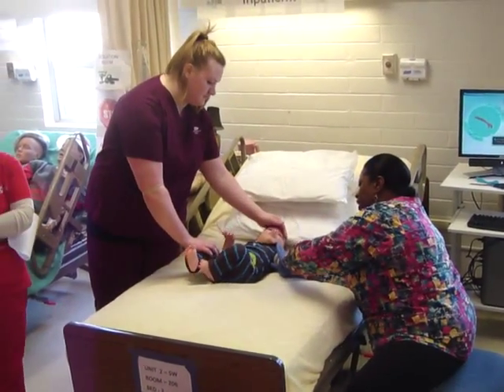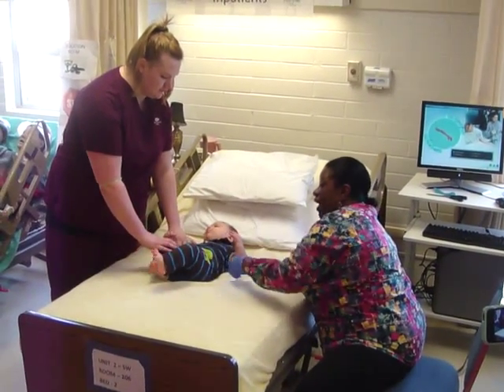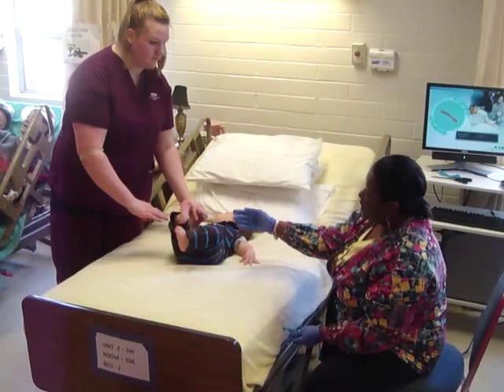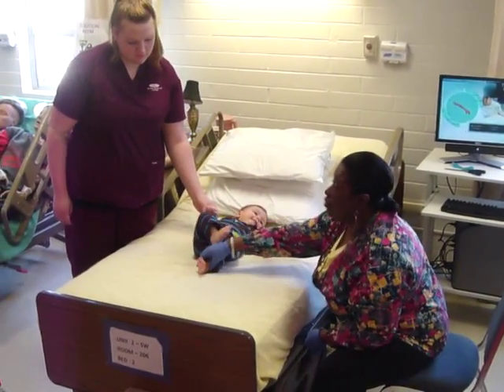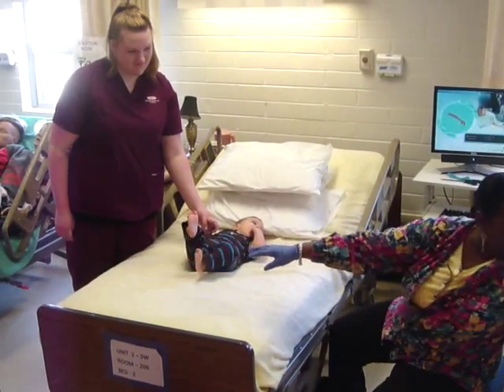If we're drawing a lot of blood, we would have to go in the arm to get that. If we're only drawing maybe a CBC and doing a PKU or something of that nature, we're going to go in the foot. Look at him kicking me away already.